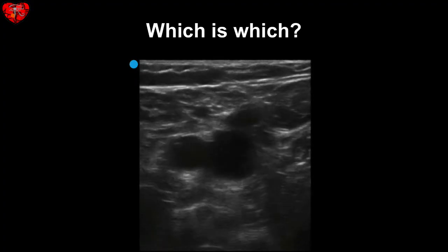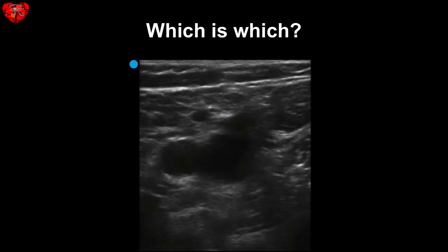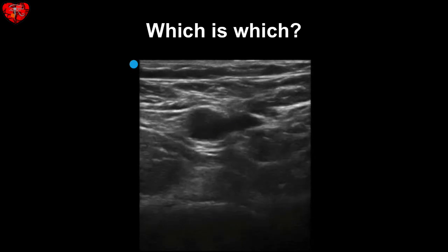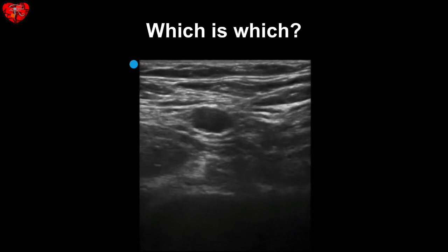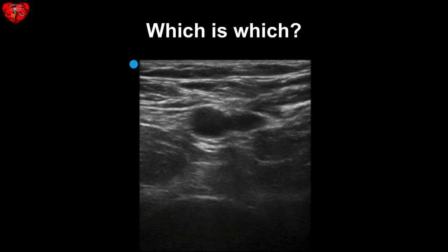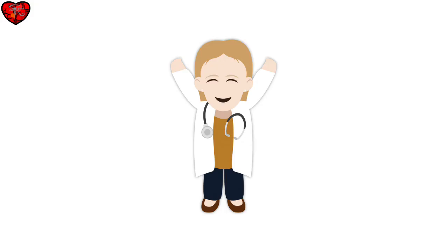Let's put it all together. Which is an artery and which is a vein? What do you think? The one on the right compresses and the one on the left looks round and has a thicker wall. This is the artery and this is the vein. Now you're an expert on telling the difference between an artery and a vein on ultrasound.